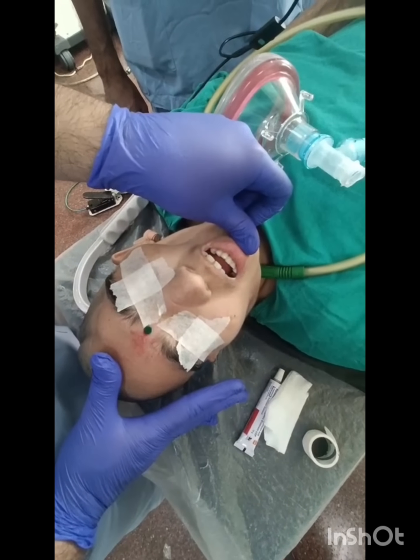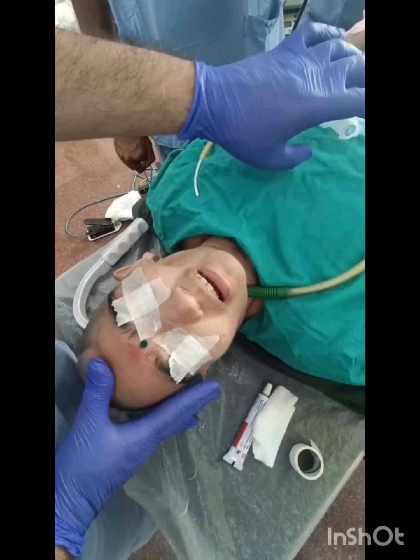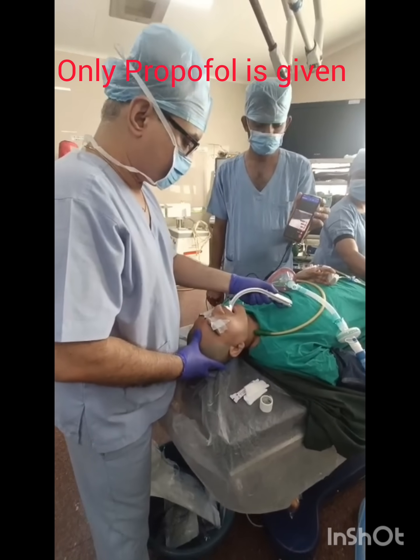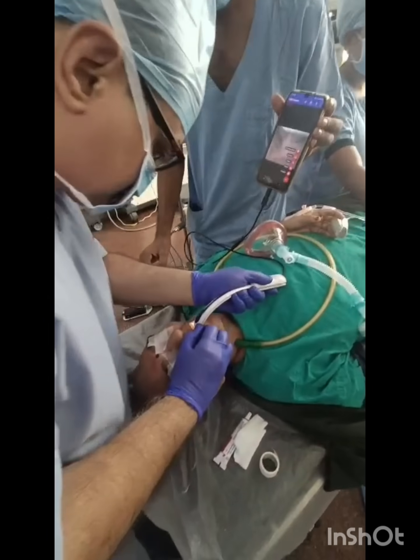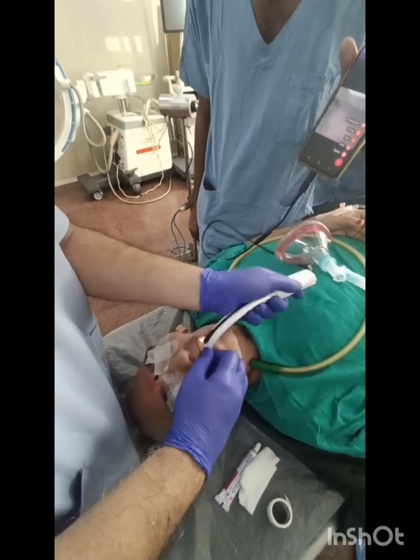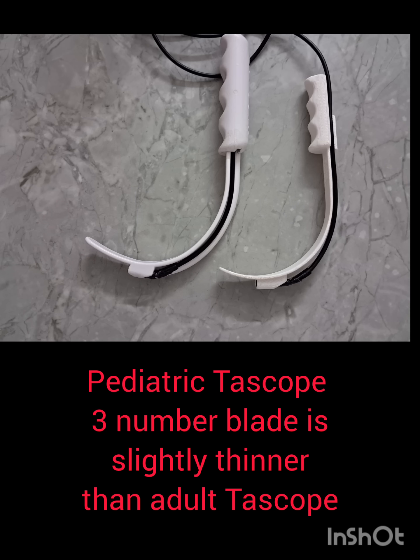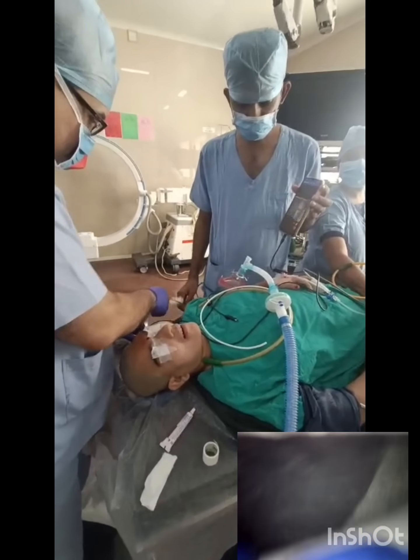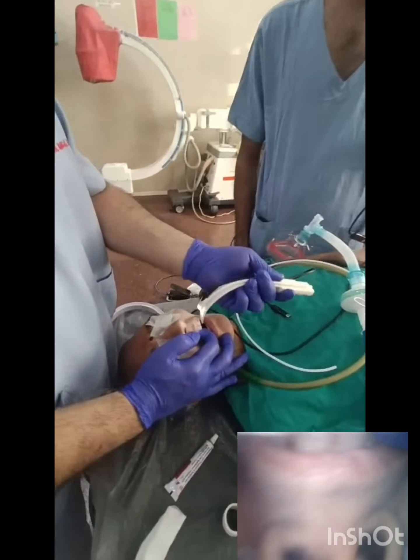You can see the mouth opening — almost less than a finger breadth. We are attempting intubation with the Tascope. Propofol induction is done and now inserting the Tascope, but the Tascope insertion is also very difficult. We are inserting the pediatric Tascope given the restricted mouth opening.